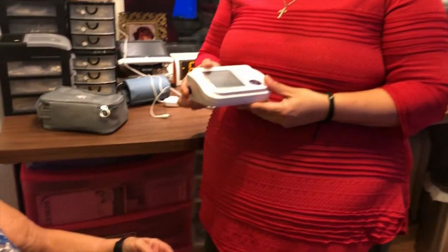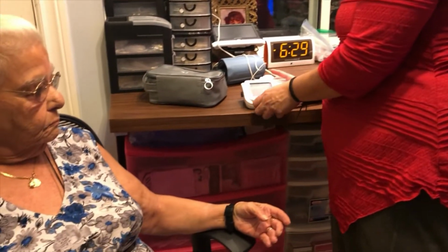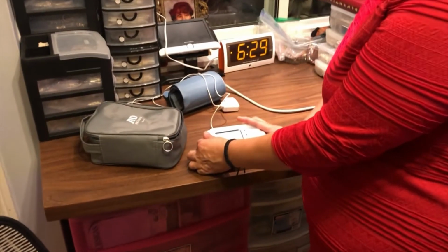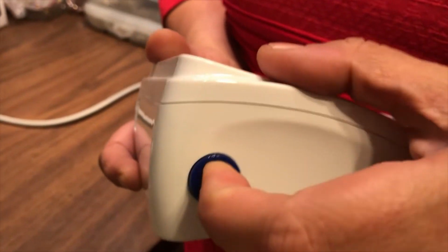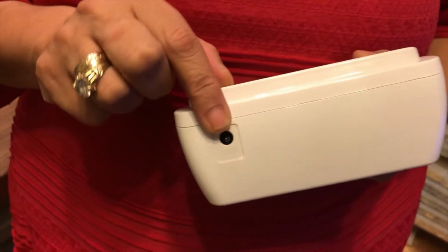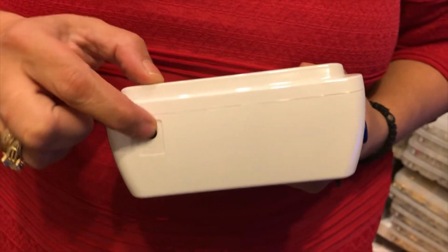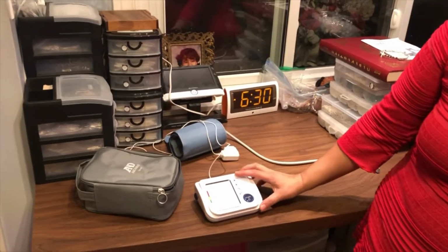I'm going to turn the device back right side up, and as you put it down, on the left hand side of the device, there's a big round, it feels like a hole. It's round, and obviously you can insert something in that. At the back of the device is a smaller hole. So obviously you insert something there. Okay? So those are the 2 holes that you need to know about.